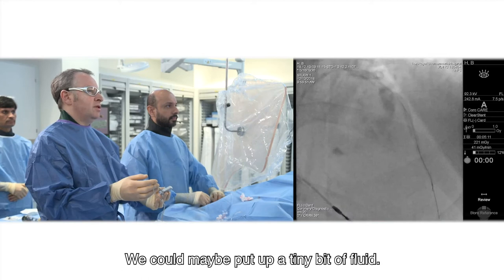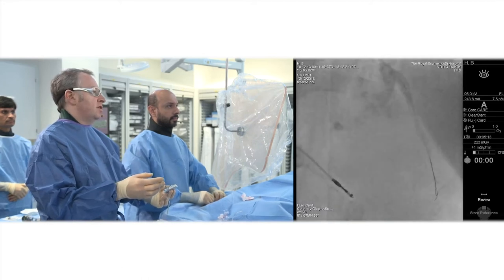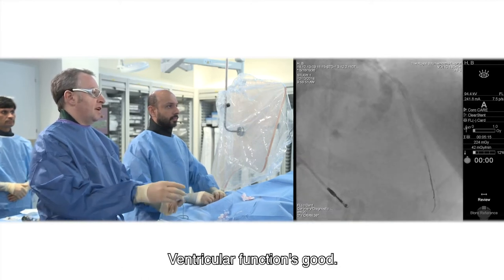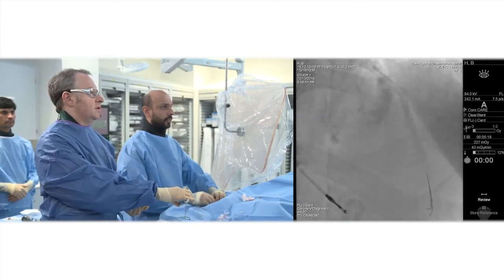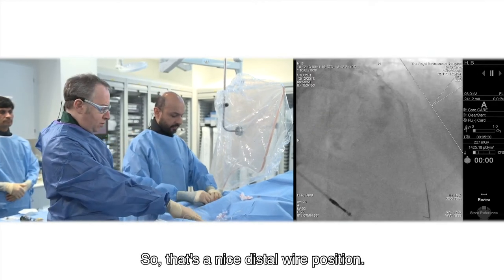We could maybe put up a tiny bit of fluid. Ventricular function is good. Fantastic. That's fine. So that's a nice distal wire position.